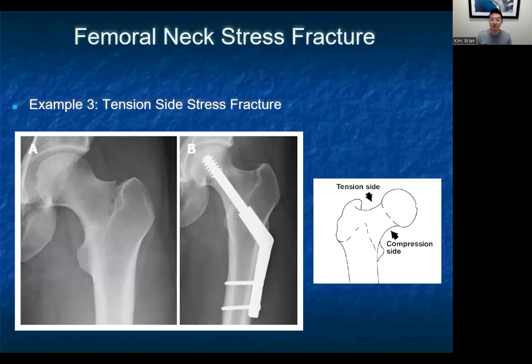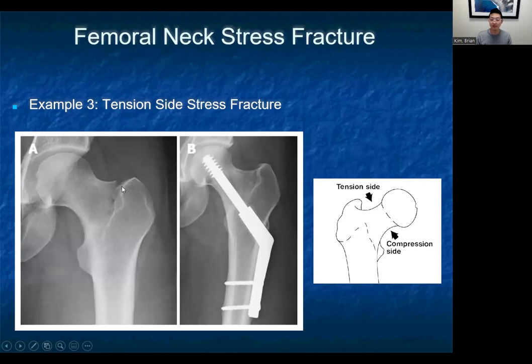An important distinction in diagnosing femoral neck stress fractures is whether they are tension-sided or compression-sided. The previous examples were compression-sided, arising from the inferior femoral neck. Tension-sided fractures arise from the superior femoral neck, which is under more tension and has poorer healing potential. These should be taken very seriously due to increased rates of progression to complete fracture and non-healing. They should generally be referred to orthopedic surgery, and patients should be sent with crutches and completely non-weight bearing.